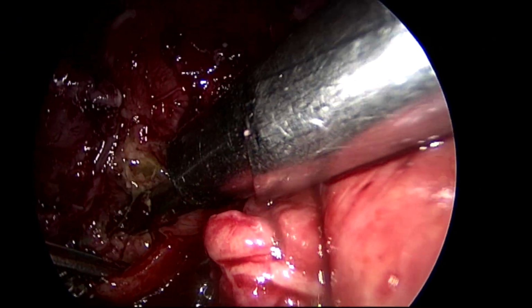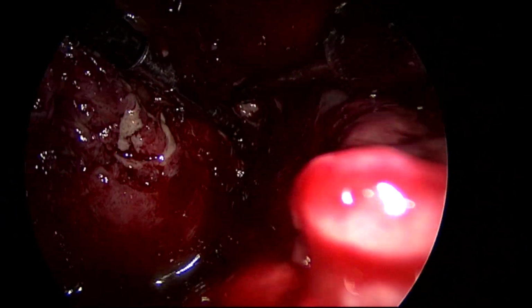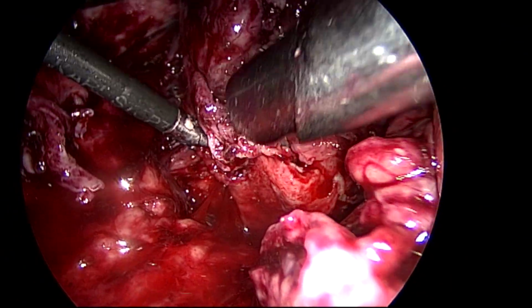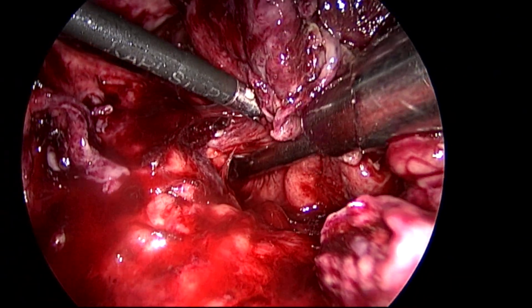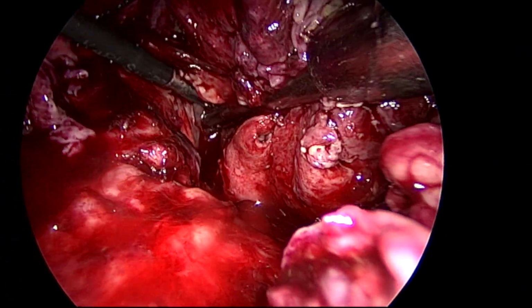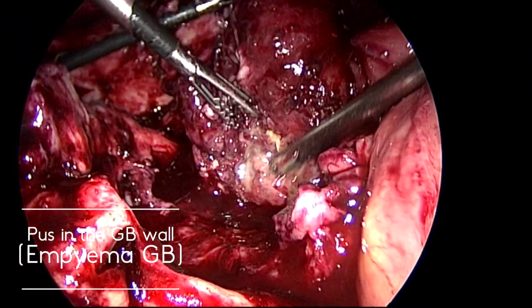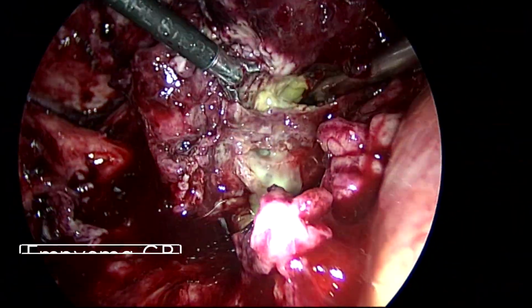Now you can see another perforation. So it is perforated at multiple levels, and my first aim is to release the omental adhesions from the gallbladder. Second, my primary aim for acute cholecystitis is to identify the infundibulum, separate the infundibulum posteriorly, and lift up the infundibulum from the surrounding structures. See, you can see the pus is coming up from the gallbladder wall. So, that is the empyema of the gallbladder.